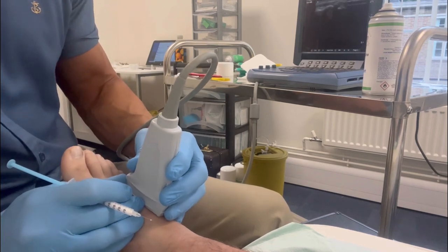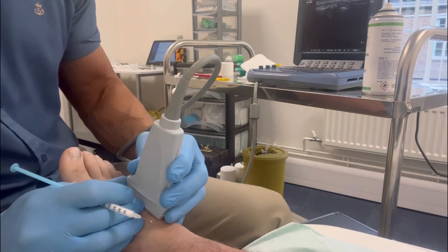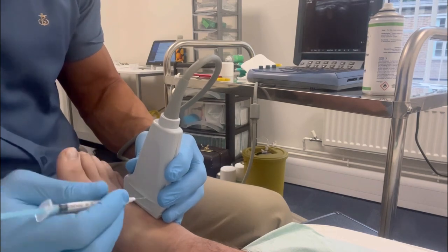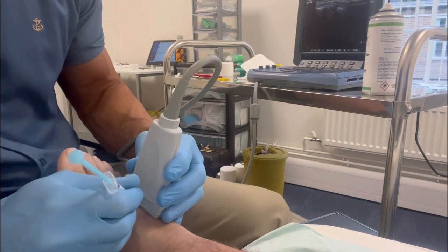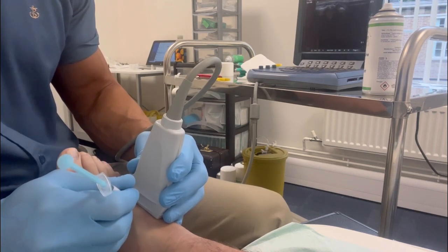You also look for as large a gap into the joint — an access point to the joint — as possible. This makes the injection as comfortable and as quick and easy to perform, so it's best for both the patient and myself.